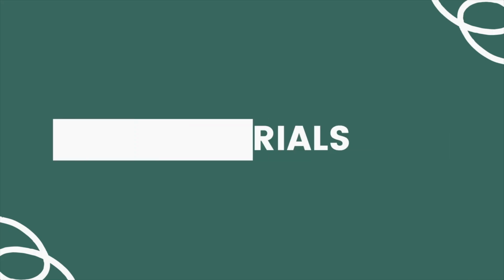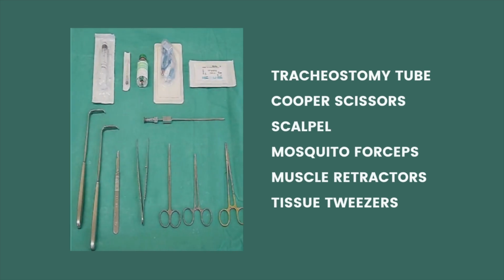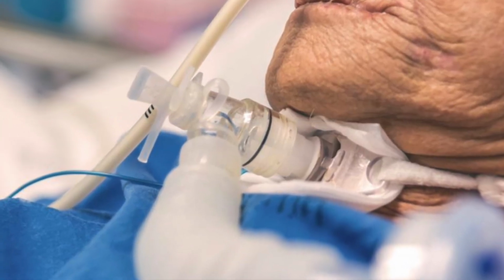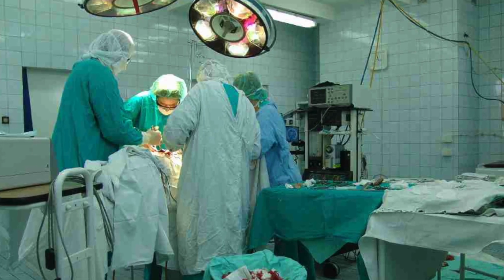Materials needed are tracheostomy tube, Cooper scissors, scalpel, mosquito forceps, muscle retractors, and tissue tweezers. Tracheostomy is best done in the OR with good lighting, instrumentation, and assistance.